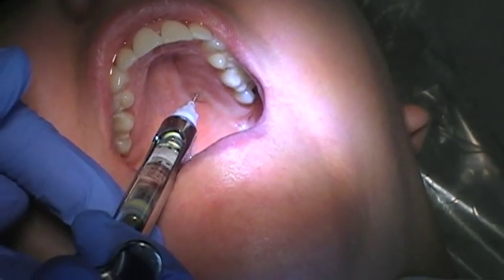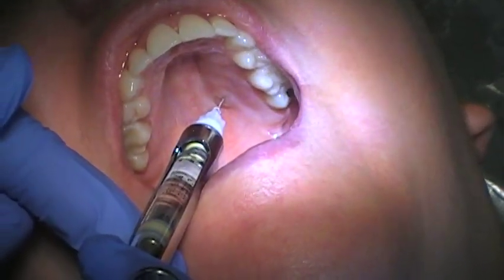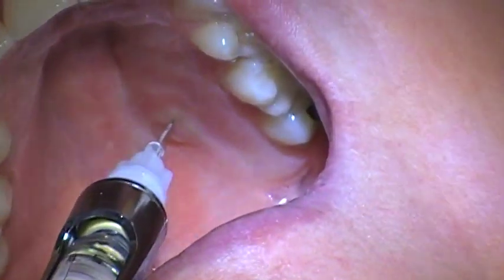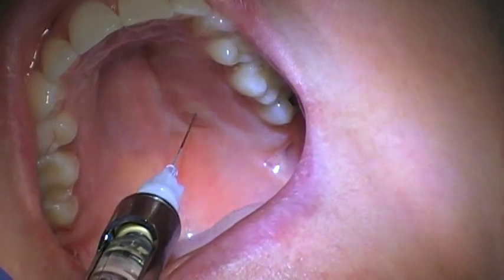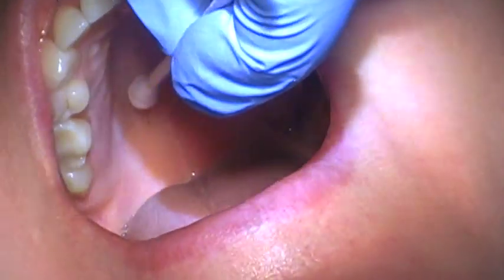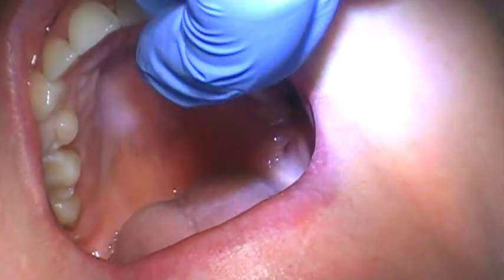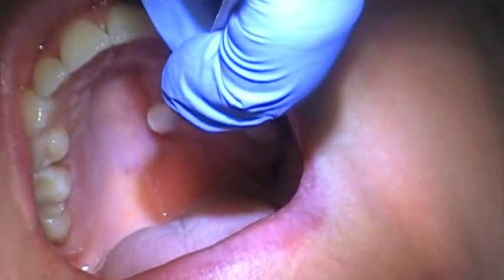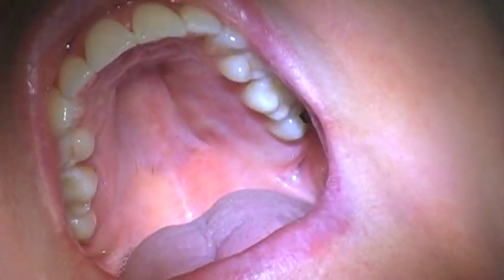Remember, the dose is going to be decided by the blanching you're seeing. I'm using plain mepivacaine for the patient's sake, and you can still see some blanching with it. However, if you're using lidocaine, the blanching is going to be even more pronounced and will start to spread. You'd want the blanching to be about the size of a nickel. The dose is usually about one-third to one-fourth of a carpule.